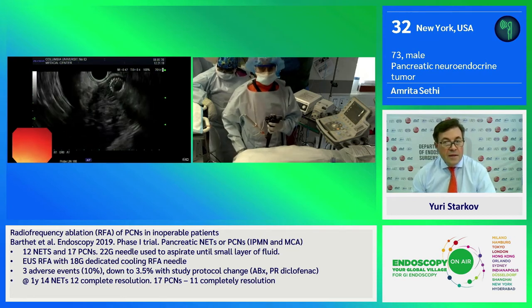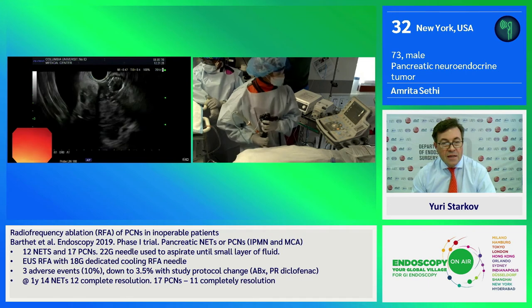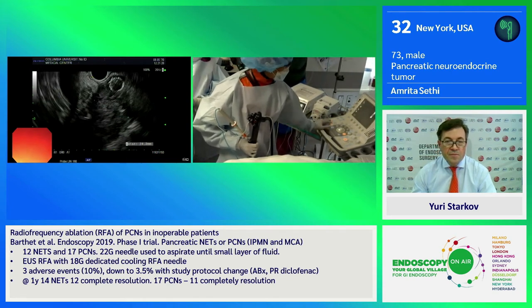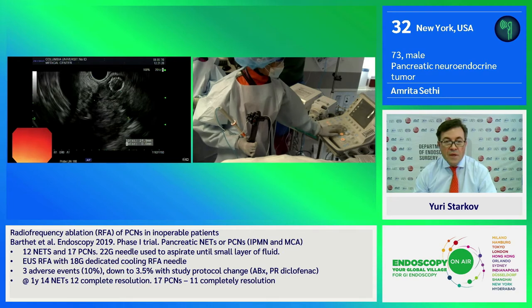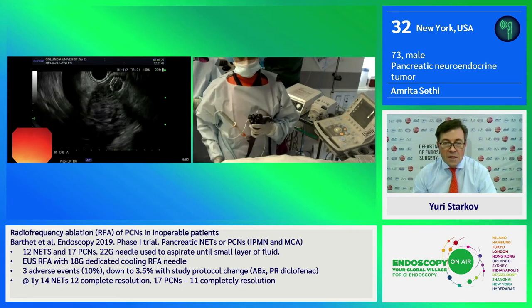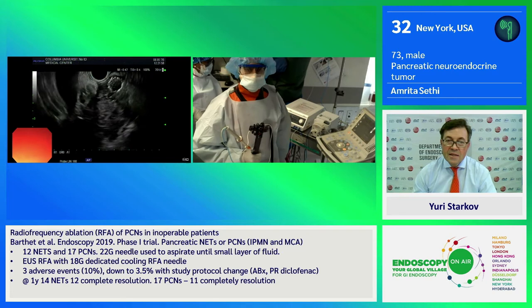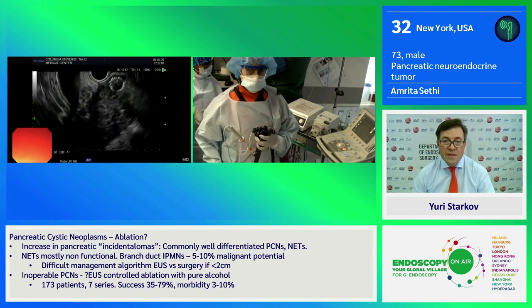There are three different sizes of needles and we choose the size based on the size of the lesion. We have measured this lesion to be about 2 cm by 3 cm, and therefore we are going to choose a 10 mm probe. The size of the probe determines the amount of energy we will use and the timing of the actual treatment. Here on the generator are our settings: we are on continuous mode and with a 10 mm probe we will use 30 watts of energy for 20 seconds.